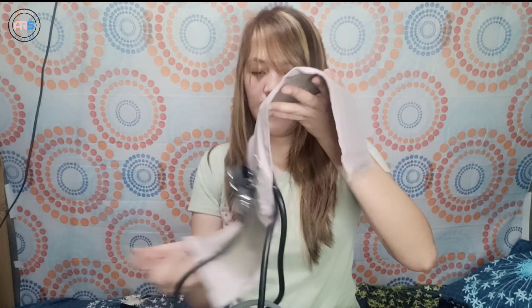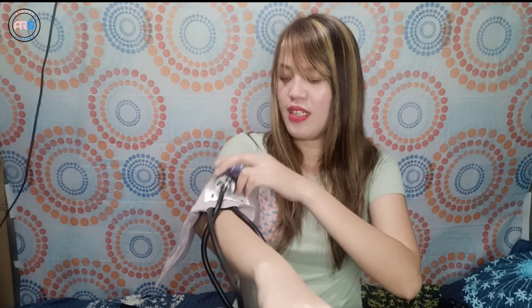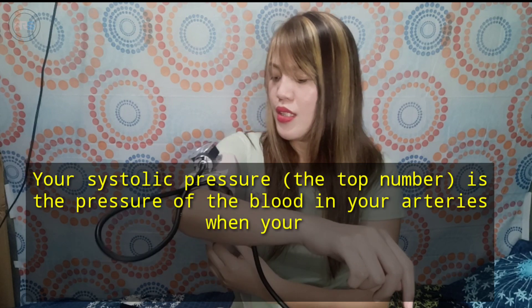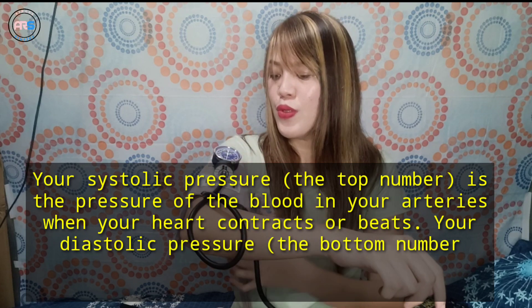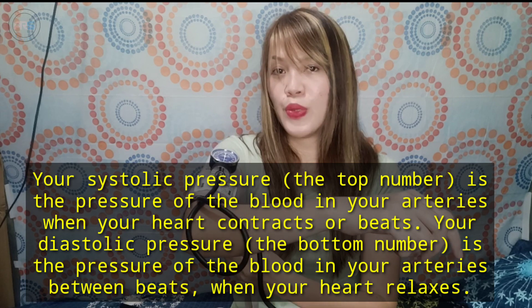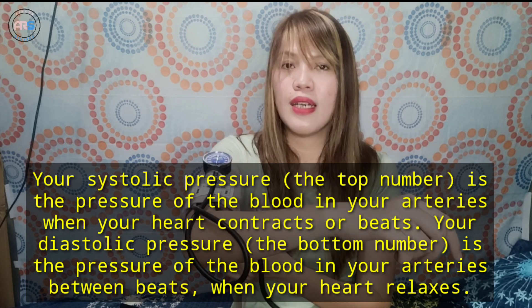Mabilis lang siyang i-assemble, di ba? So, pwede ko na agad itry sa sarili ko. Paano malalaman yung BP natin? It's systolic over diastolic. Yung first na tutunog, yun po yung pinaka-systolic natin. Then, yung last na pulse na tutunog is yung ating diastolic.